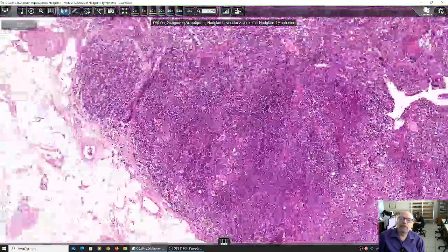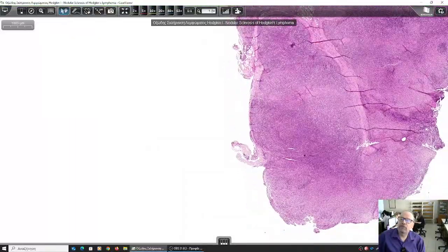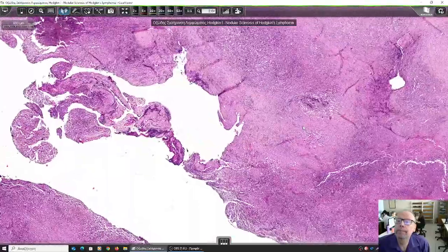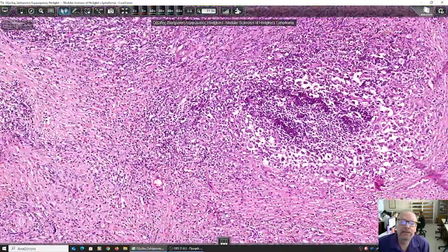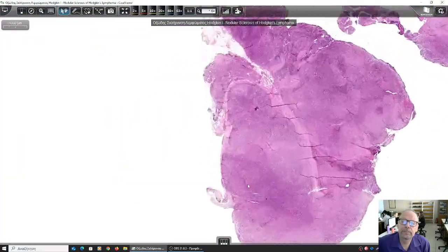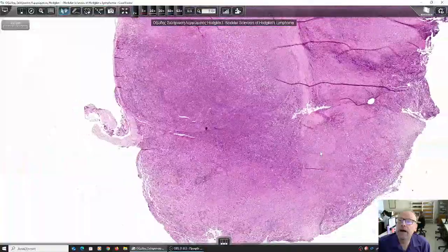And the last question in this lymph node with the nodular sclerosis, you see the bands of fibrous tissue. The last question is, let me see. Here we have again the malignant cells. If I can find that, I'll ask you. If I cannot find it, I cannot ask you. But I'll try.